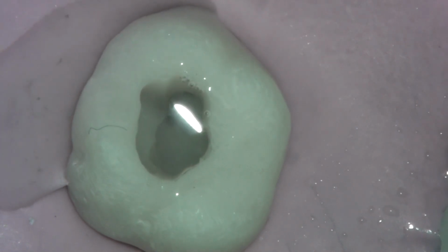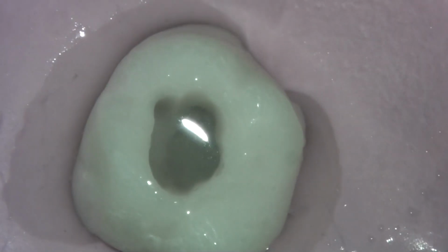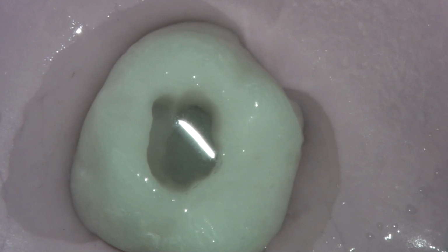Now at this point you will switch to possibly a 25mm size 10. It depends on the degree of difficulty of the canal. We have estimated the length in this root to be 21mm. So if you feel that your size 10 21mm file is quite loose, I would at this point clip my apex locator, and I would establish a length.